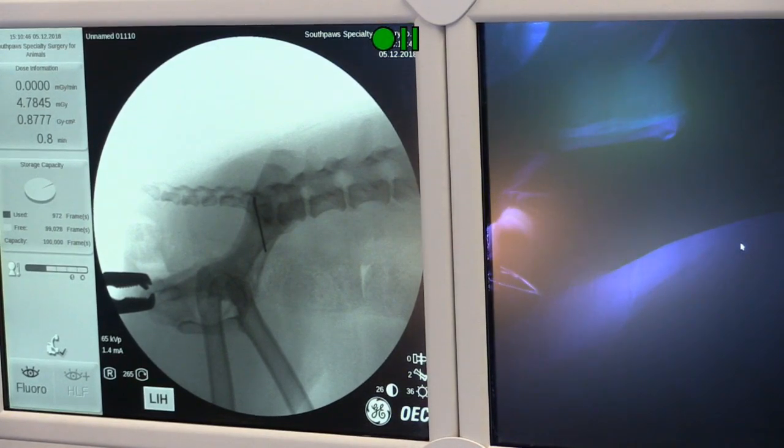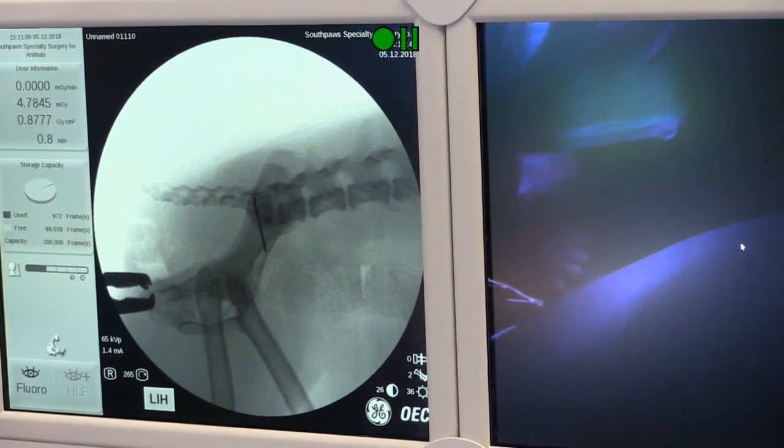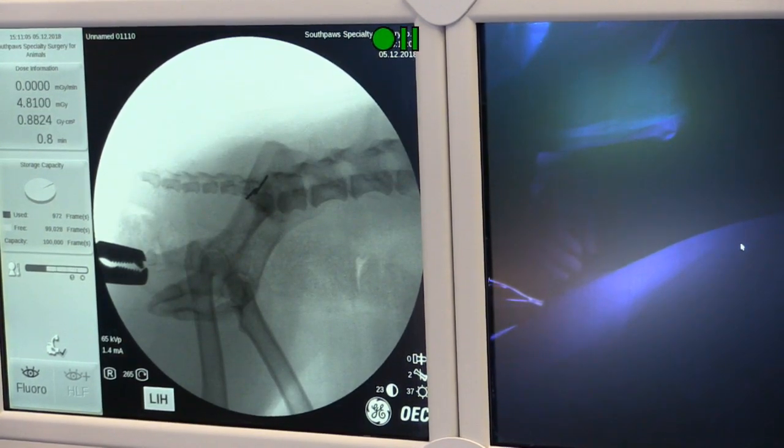So the pin is just for positioning the bone and holding it still while he drives the screw. And if you were to use a cannulated screw, then you would have to put a pin exactly in the proper position, because that's going to be the guide that the drill is going to drill over, and the screw is going to be screwed in over as well.